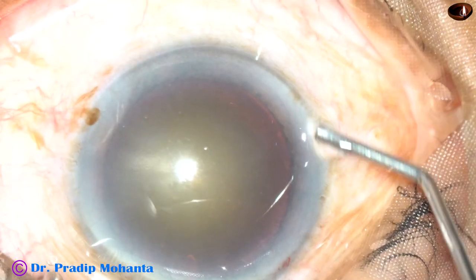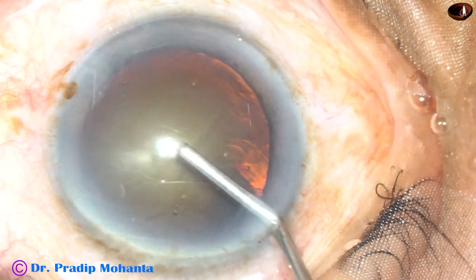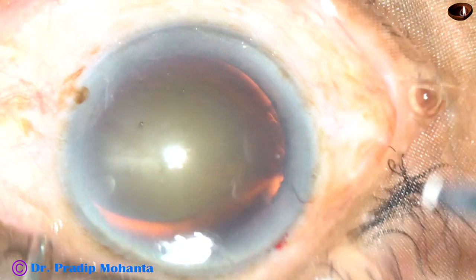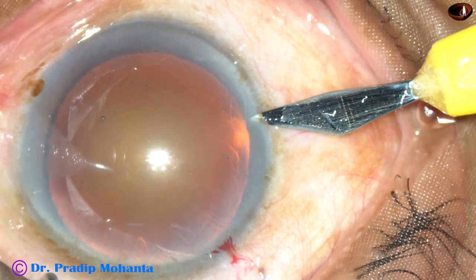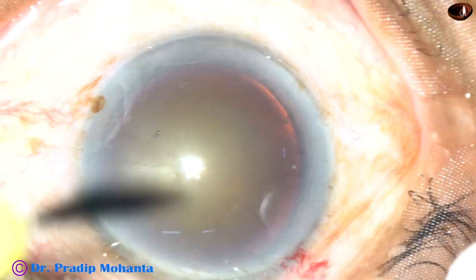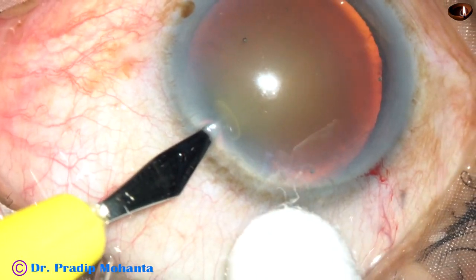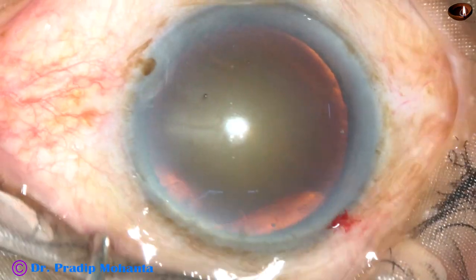2% hydroxypropyl methyl cellulose is being injected into the anterior chamber. And then two side ports are being made. This is the side port on the right side of the main incision, and this is another side port on the left side of the main incision.